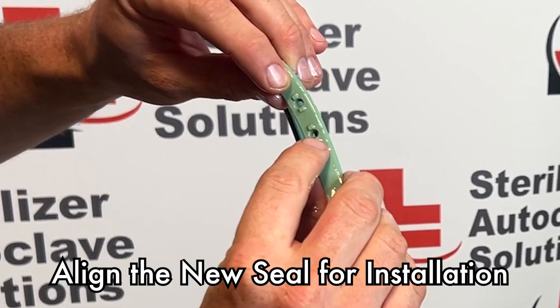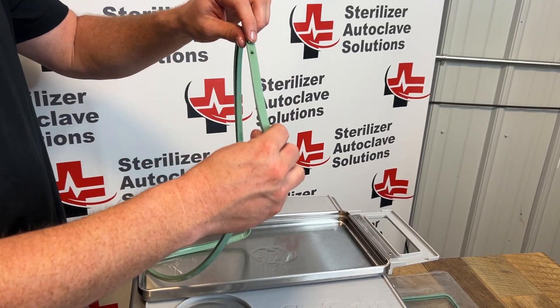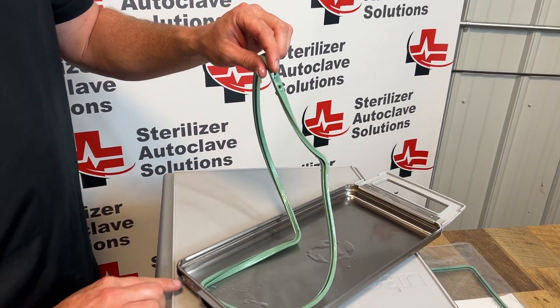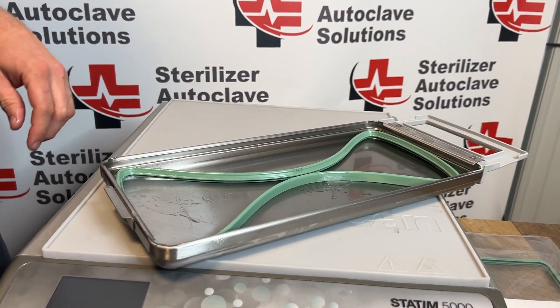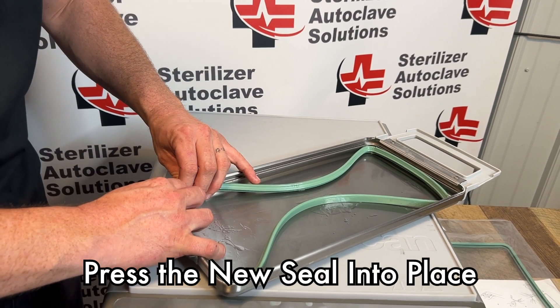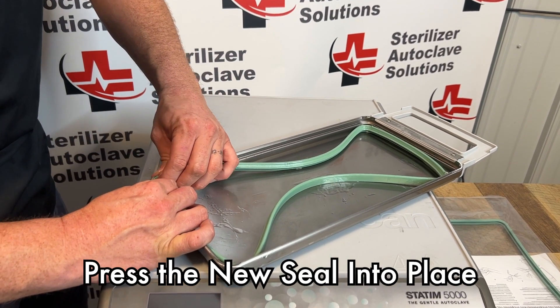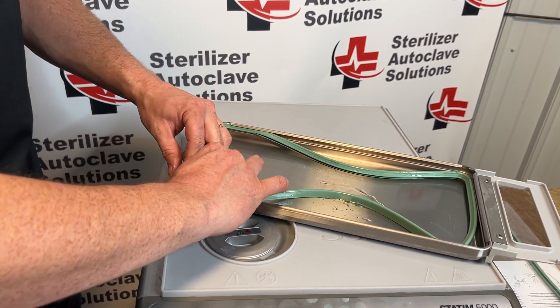We want to find the holes on the back and the nubs on the top. We're going to take those nubs, match them up with the back of our cassette, and gently place the seal in. We're going to start in one of the corners by pressing in and up, trying to line up the nubs in the corners. We're going to do that to all four corners.